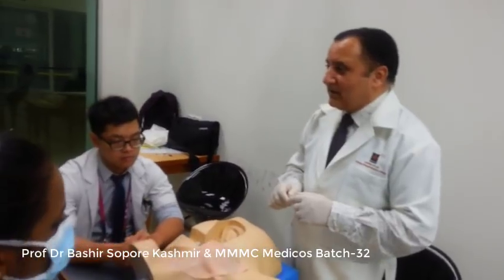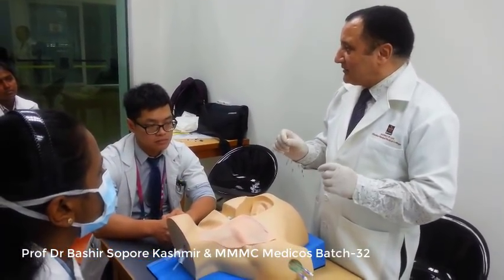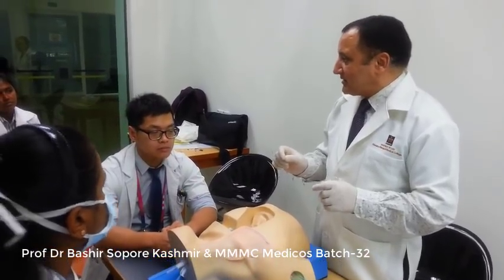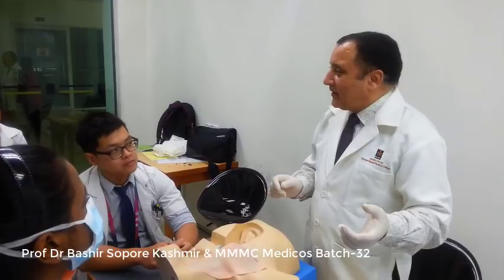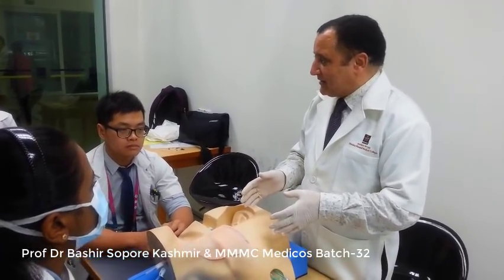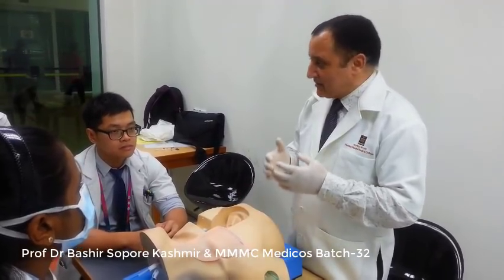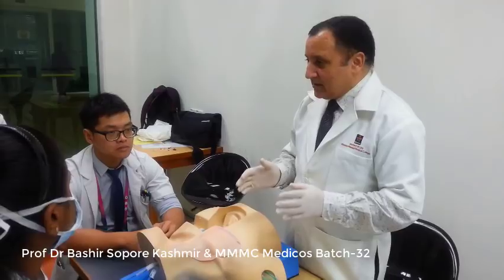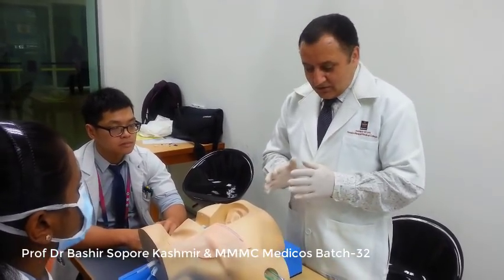One important factor is that the success rate of catheterization has improved after ultrasonography. So if you do central venous catheterization under the guidance of sonography, then the success rate is very, very high. It is rare that you will fail. You got my point? So this was all.